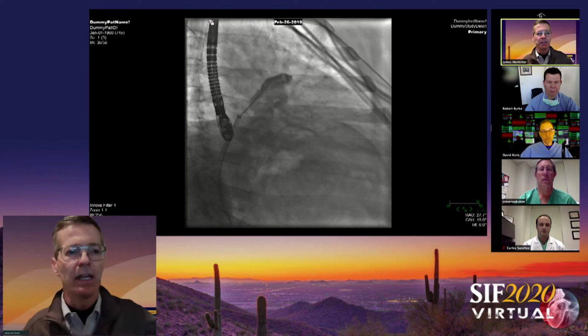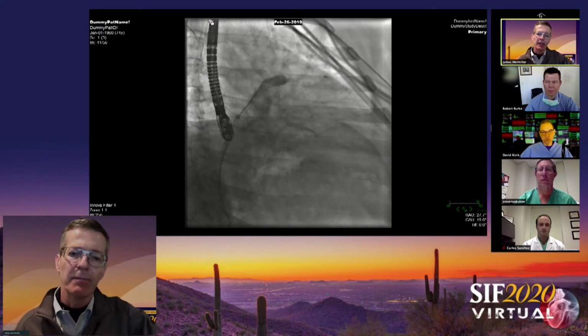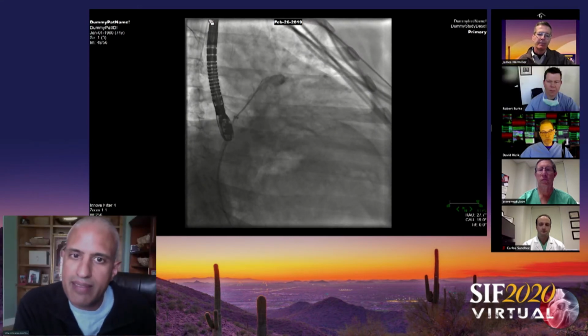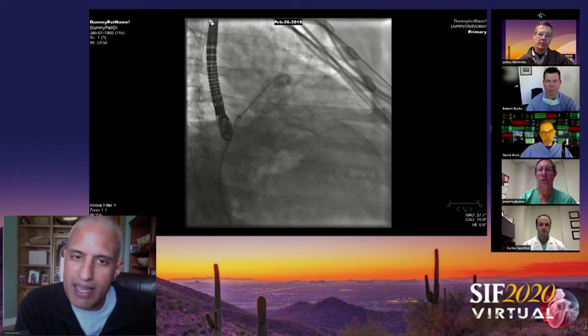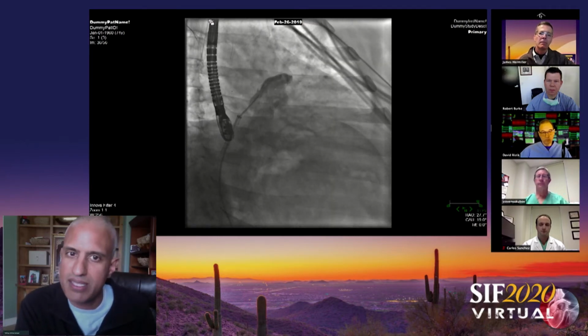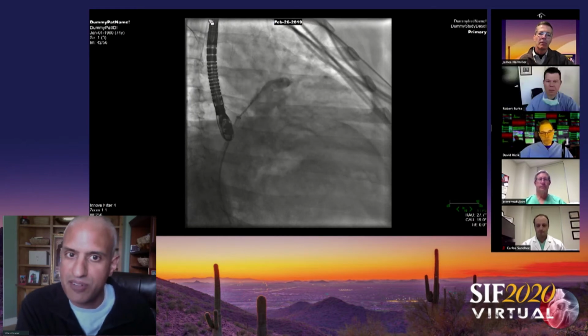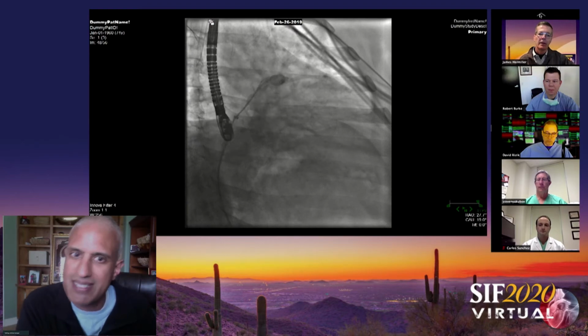So Srini, can I just ask you one question? Do you use CTA, cardiac CTA, much at all? We actually do not use it as much because I think it's variable. When I've used CTA in the past, and again, I've become a fan of it, but not so much so that it's supplanted my use of TEE. And I know that certain sites have gone, quite honestly, to CTA first. How about you guys? Is there anybody in the panel that feels CTA should supplant TEE?